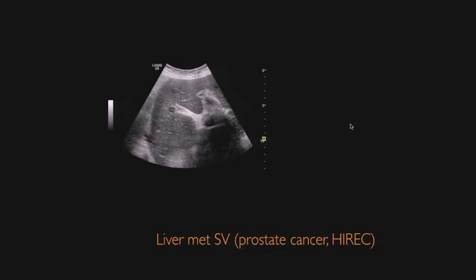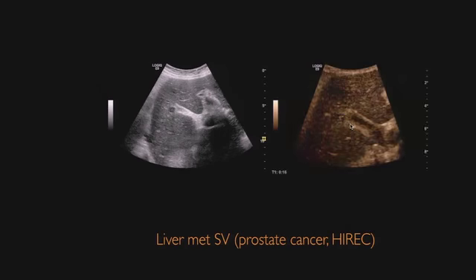The lesion is measuring 6 millimeters in size. You can see it here. The gallbladder has been removed, and you can see the lesion, I think you can see it with the echo-poor rim and the echogenic center. And then we give contrast, and this is an accumulation mode. In the accumulation mode, you can see very nicely that single vessels, arteries are entering the tumor, so it's being vascularized during this arterial phase. So this characterizes the tumor, and you can see they are more or less chaotic vasculature.